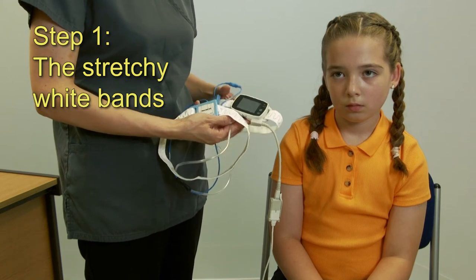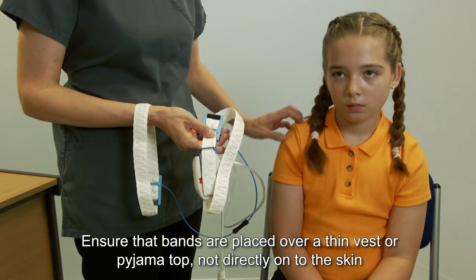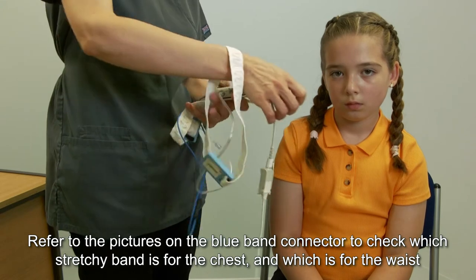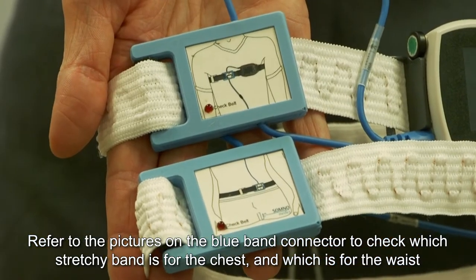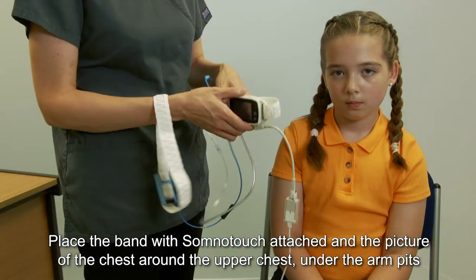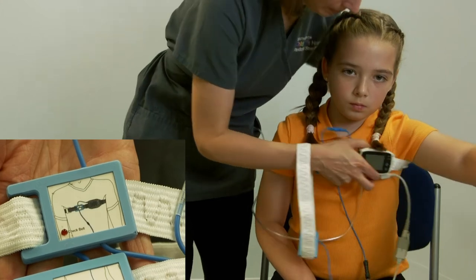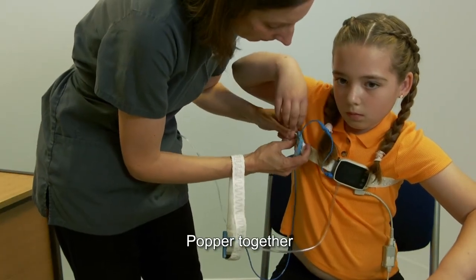Step one: the stretchy white bands. Ensure the bands are placed over a thin vest or pyjama top, not directly on the skin. Refer to the pictures on the blue band connector to check which stretchy band is for the chest and which is for the waist. Place the band with the SomnoTouch attached and the picture of the chest around the upper chest, under the armpits, and pop it together.